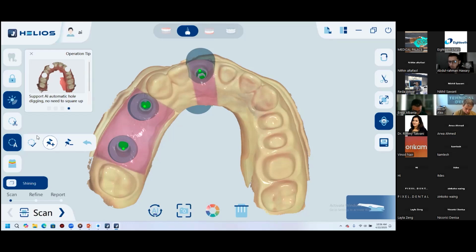Currently, I do not have any dentures or any edentulous cases to scan, either by blocks or anything, because I did not prepare for something like this. But I would be happy to prepare something like this and share it with you. Yeah. Okay. Thank you. But it's possible, using the triple tray? Yeah, I will actually start preparing for something like this, and we'll share it with you.